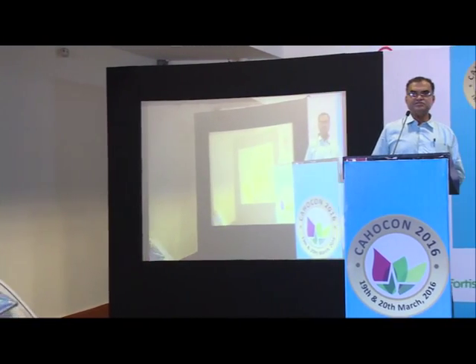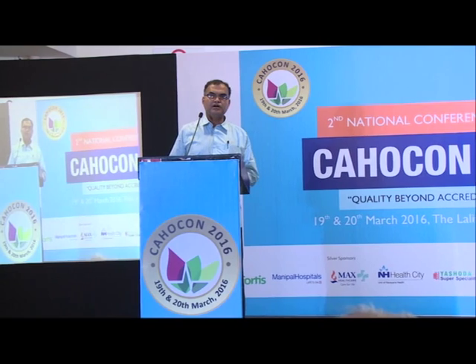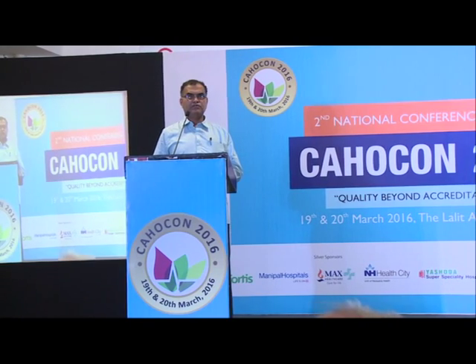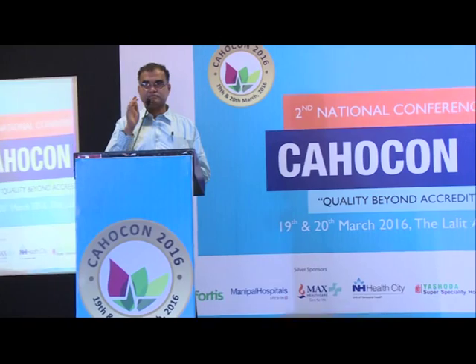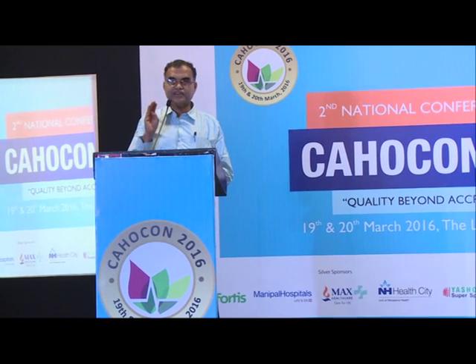What is your opinion on the usage of other BLI combinations apart from piperacillin and tazobactam? Clinicians will be using ceftriaxone-sulbactam and cefepime-tazobactam, and they will ask us whether it is sensitive or resistant. But there are no clear-cut guidelines for the ceftriaxone-sulbactam combination, no zone sizes, nothing. Then how do we interpret and answer them? It is very, very difficult.